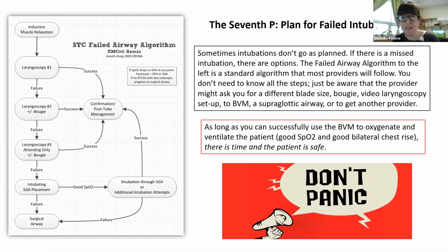You always move to the next step. And if there's a patient that there's a lot of concerns about the intubation itself, then that needs to be a really good discussion before anything moves forward, so that everybody's on the same page and knows what the plan is if there is a failed attempt.